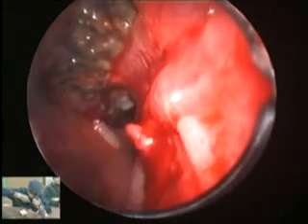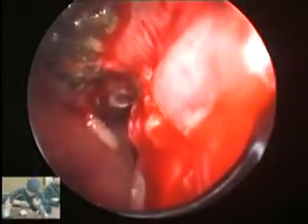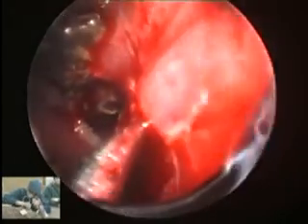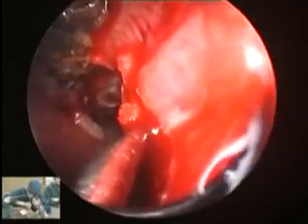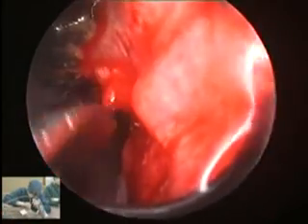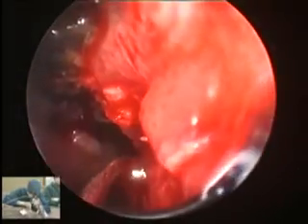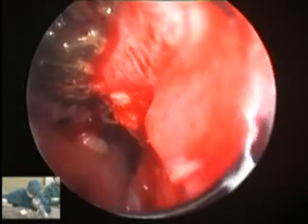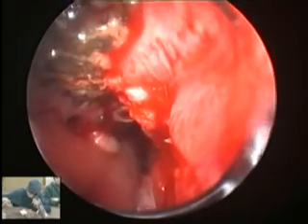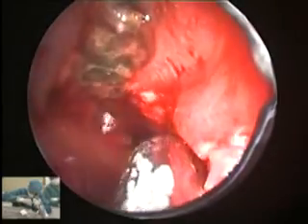Just a point for those of you who are starting off on your sinus surgical careers, if you're going to be doing a lot of sinus surgery, you really should try and learn to operate off the television screen, because ergonomically you can end up doing significant damage to your cervical spine and getting significant problems in the long term. So just be aware that if you do a lot of FESS, it's probably better to learn to operate off the screen.